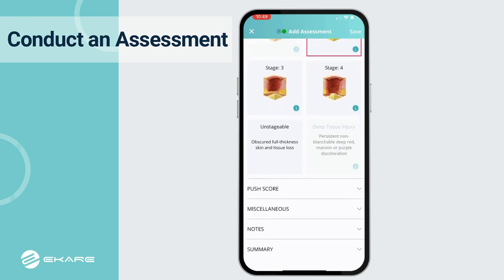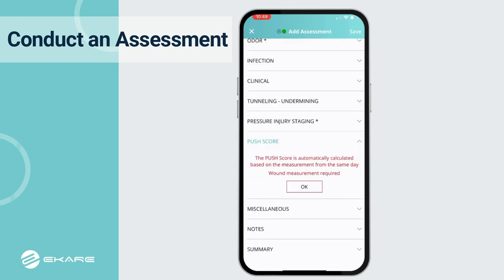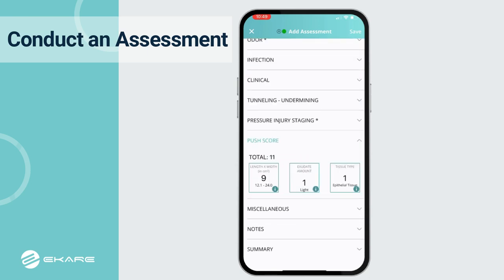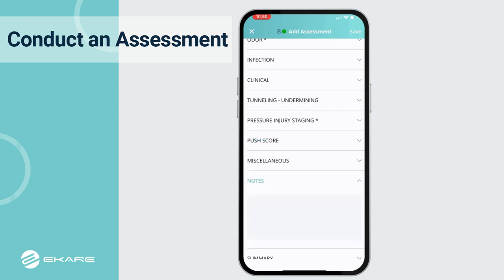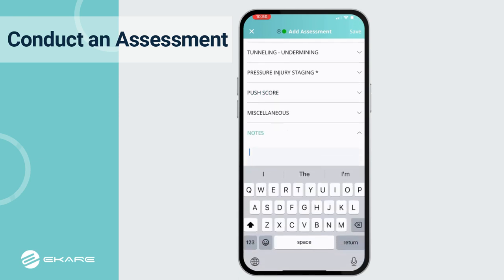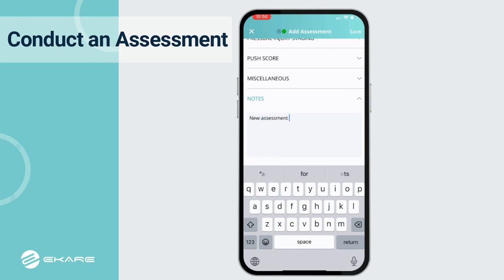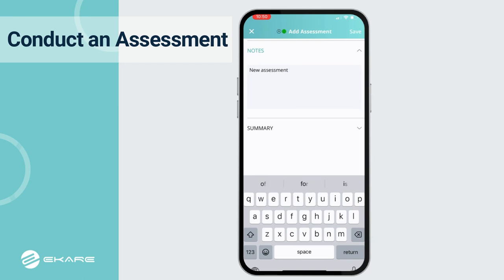A PUSH score will be automatically generated. Additional items can be captured to ensure a full assessment is documented. The Notes section at the bottom can be used to document additional information as needed, and a summary will display all information saved.